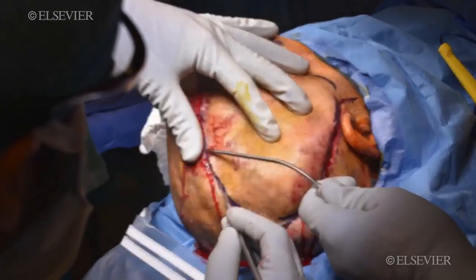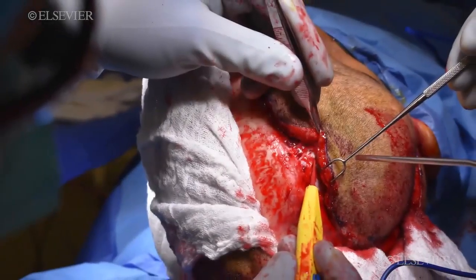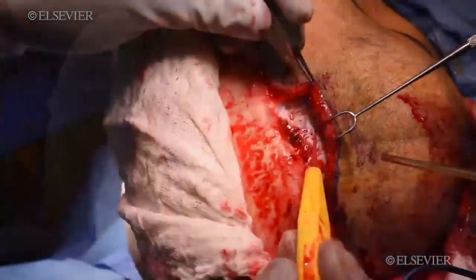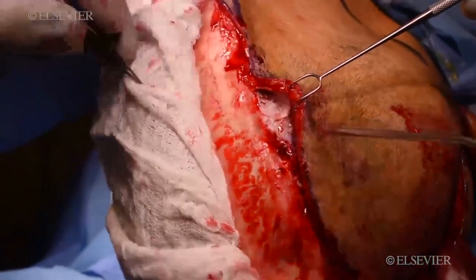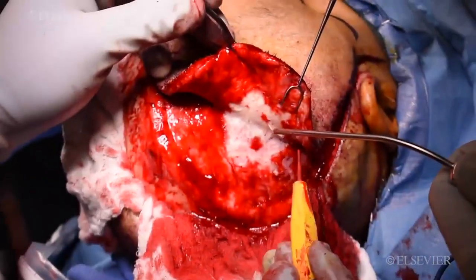First, the scalp is injected with diluted epinephrine, followed by needlepoint electric cautery and dissection through the previous scar. At this point, under loop magnification, the needlepoint electric cautery is used to dissect the stable scalp away from the skull defect. At this point, we start the pericranial onlay dissection in the subgaleal plane along the loose areolar tissue.